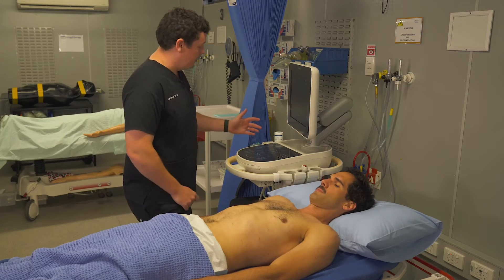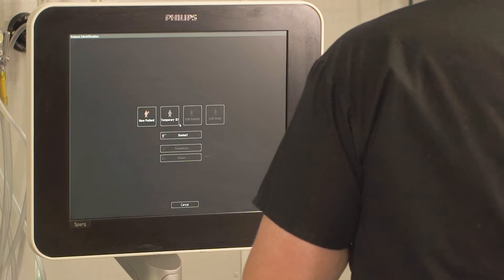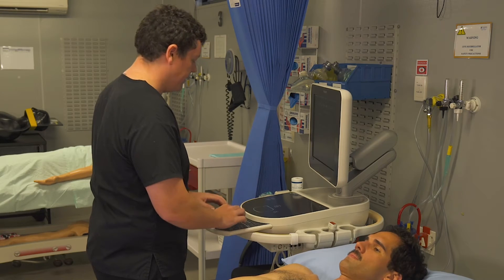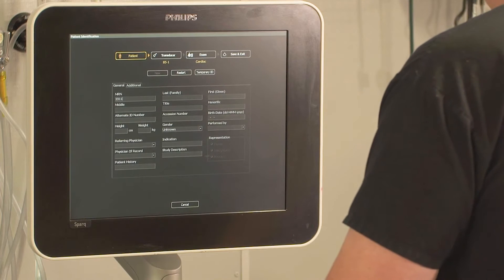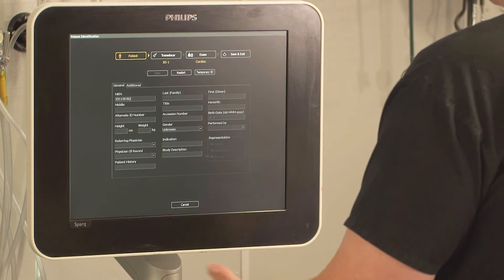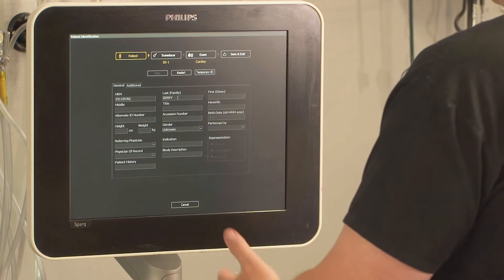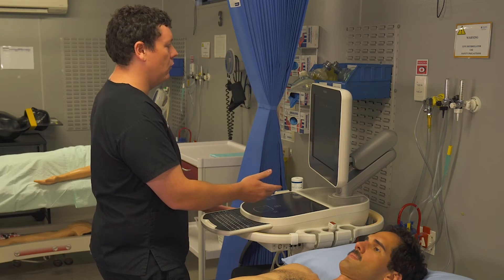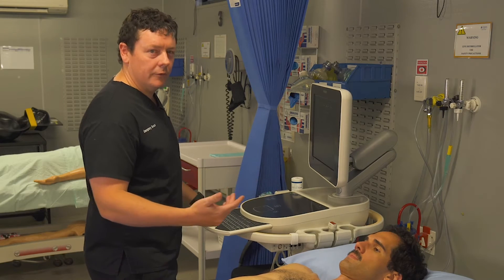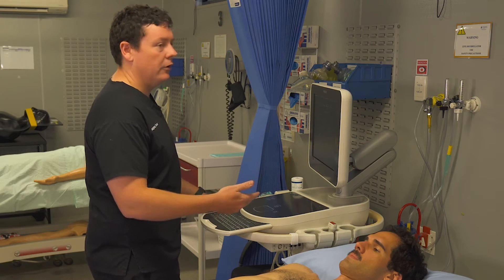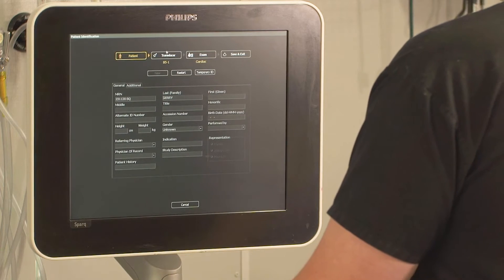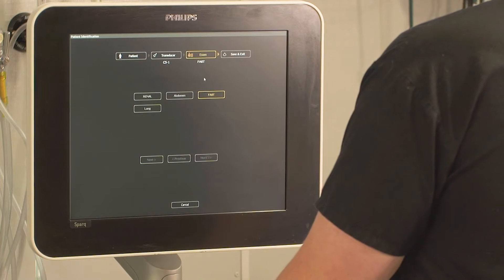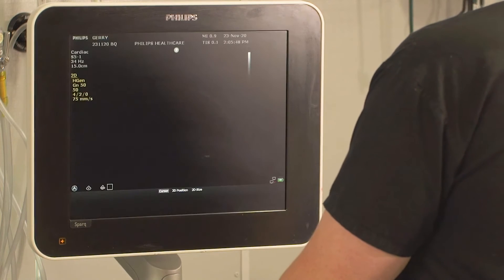To start the exam, hit start and register a new patient. For today's purposes we'll use the UR number as the date, put my initials in the protocol field, and use Jerry as the last name for our model. If I'm proctoring someone, I'd put myself as the performing doctor so I know who performed and who proctored the scan. From here, choose the curvilinear probe, select the FAST presets, then save and exit.